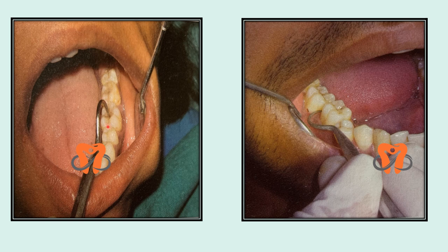Now, this was the occlusal surface. Similarly, the explorer is passed on the proximal surface also, like here. And again, in case there is any catch on this surface, it will indicate there is caries, or there is roughness when you pass the explorer. Again, it will be an indication of caries.